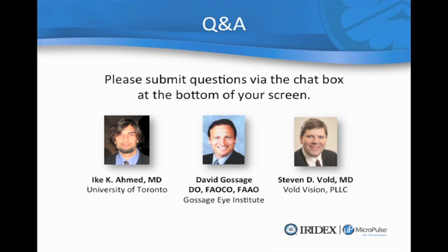Yeah, I'm in the same situation with David. Honestly, I think I probably undertreated a bit over the first year significantly, and over the last 3 to 6 months, I've really increased the power settings, and I think I've really benefited as far as the amount of efficacy. Now, I'm not sure I'm going to need to go up to 1,500 milliwatts to get an adequate treatment here. I've really been pretty pleased, honestly, with 1,000. And to be frankly honest with you, as David said, when you get up at 1,000, they can start to feel this a little bit. So there's something going on. I think I'd have some very unhappy patients if I started using 1,500 milliwatts of power.